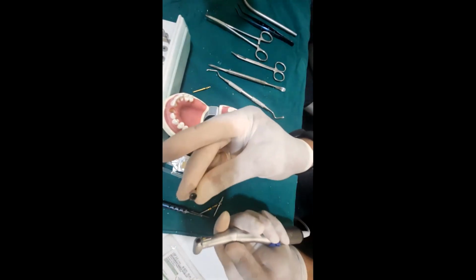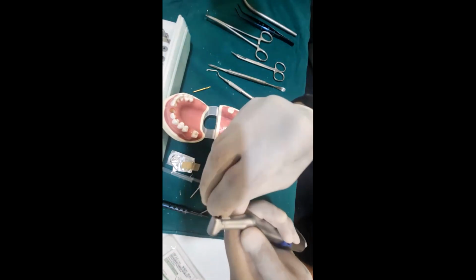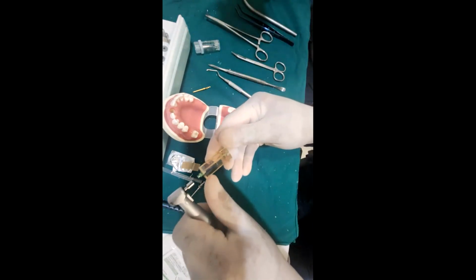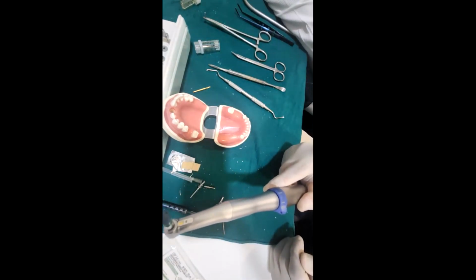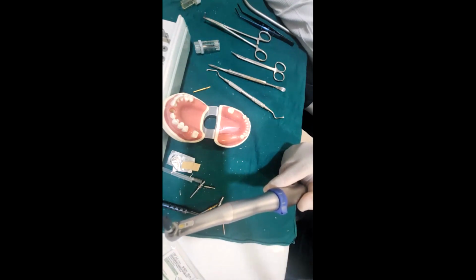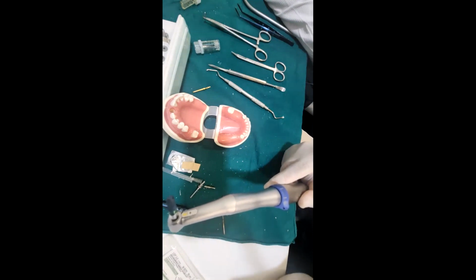This is the implant carrier driver which is connecting to the implant carrier. You open it, you snap fit it, and are you ready to go? No, you are supposed to check your implant motor settings. You are supposed to go to a pre-programmed setting where you are in the implant fixture placement mode, which is a speed max of about 25 to 30 RPM and a torque of 35 to 40.